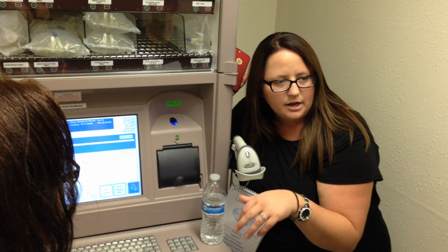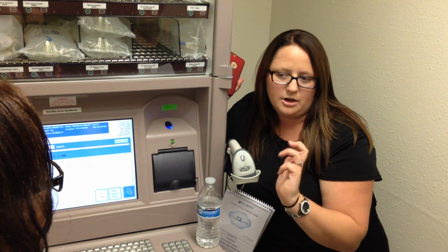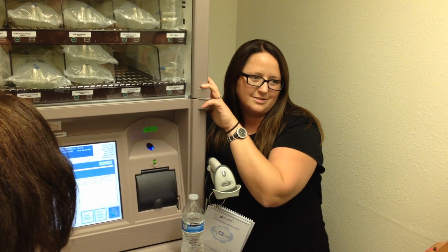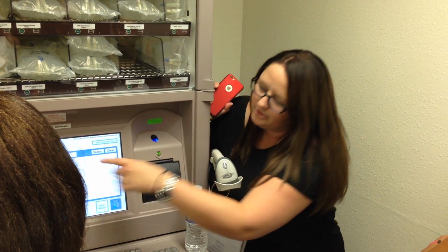Sometimes it'll do that also with nebulizers or inhalers, or a bottle of Roxanol, or a bottle of oxycodone. Those are issued out per mLs. The system recognizes it as a bottle, not mLs. Does that make sense? Okay. So that's just so you can see a patient profile.